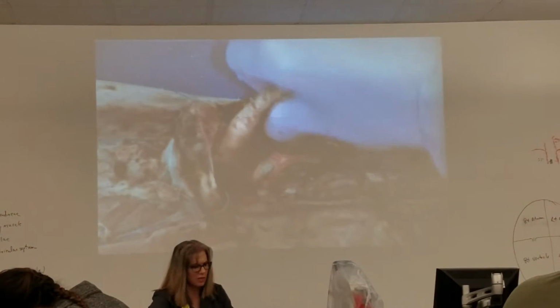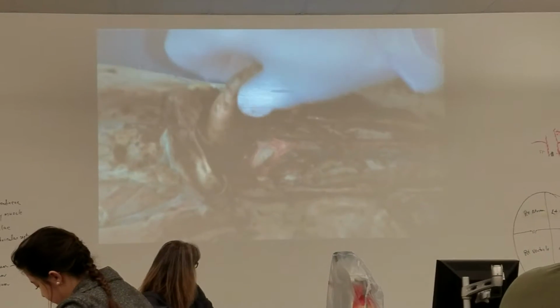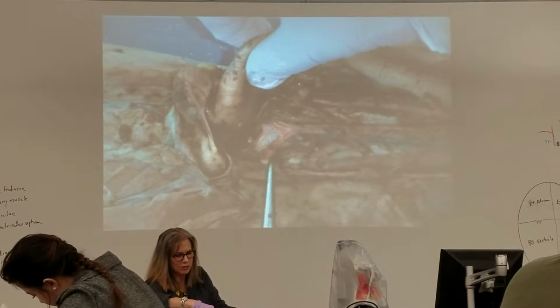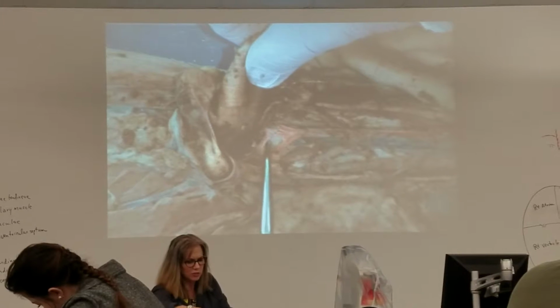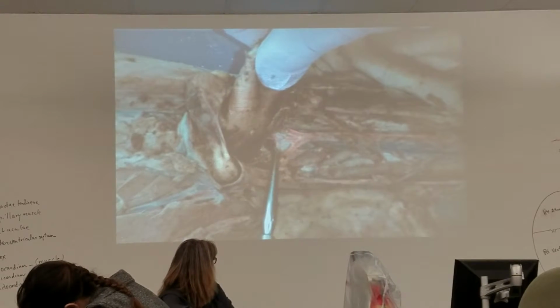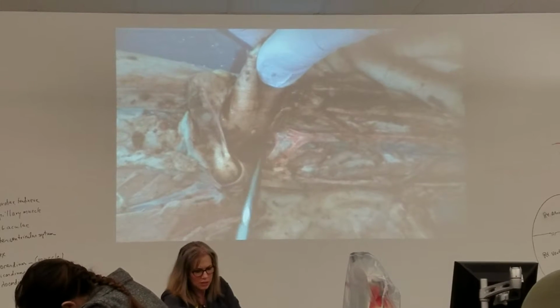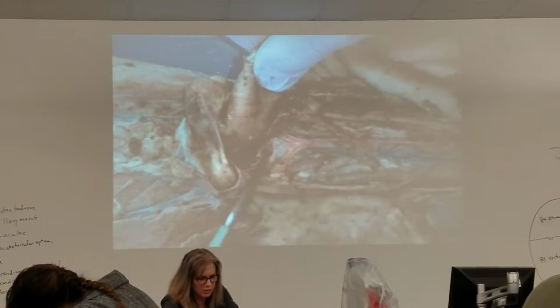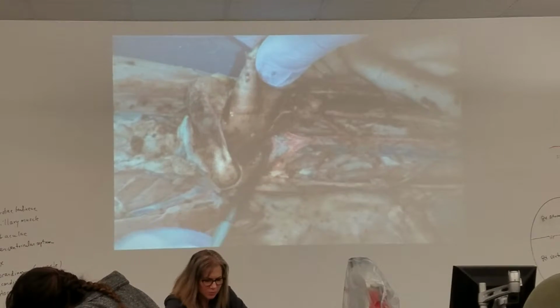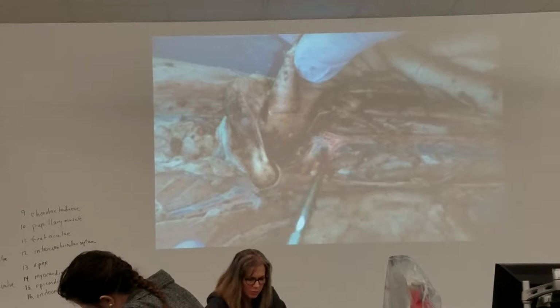So again, to just recap, right here I have my external iliac and my internal iliac, and going straight down right there where the probe is touching and pushing, that's going to be my caudal. I move the caudal right back over here. I try to loop him, but can't quite loop him and get him under my probe or above my probe.